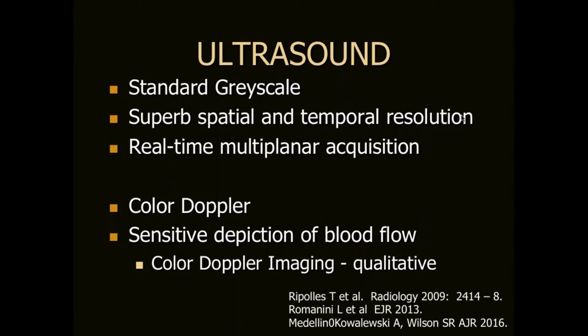And so color Doppler has also been touched on. It is a sensitive depiction of blood flow, and color Doppler imaging is a qualitative assessment of the enhancement of the bowel, and this is an estimate, of course, of disease activity.